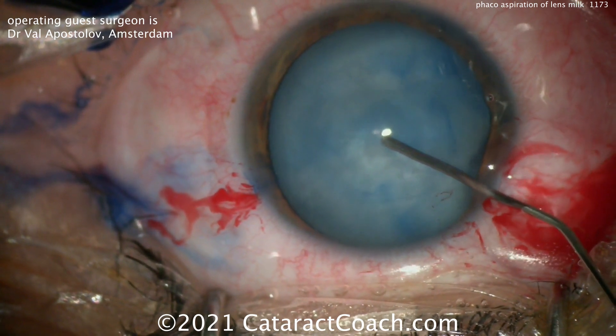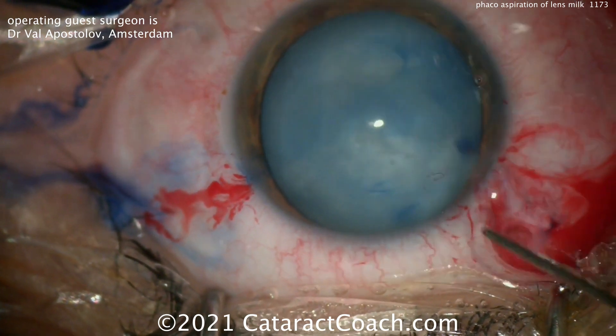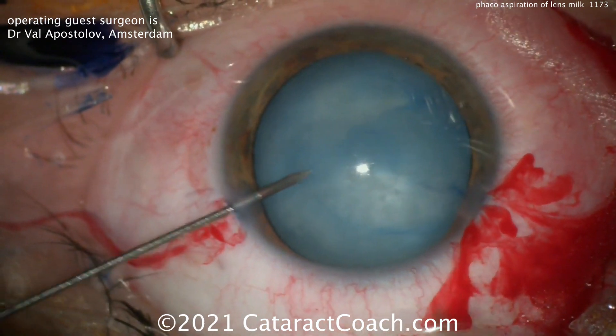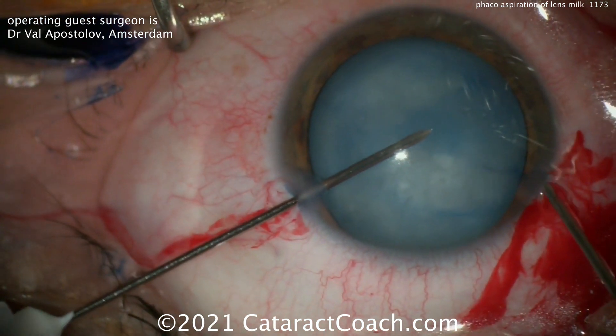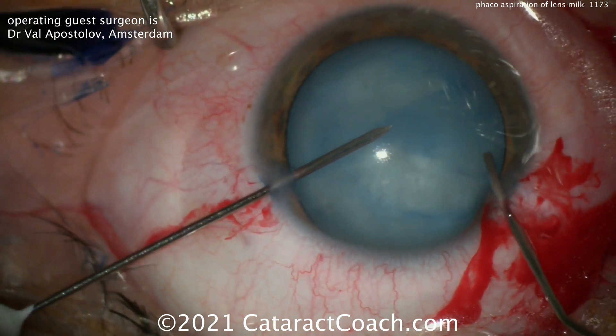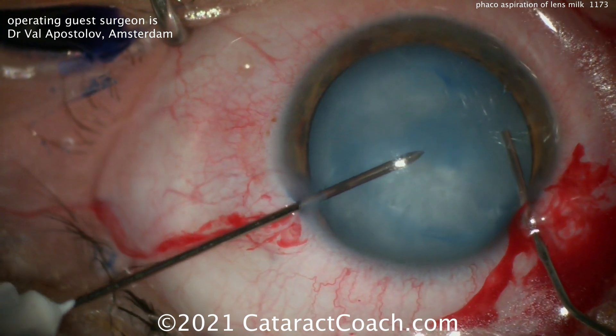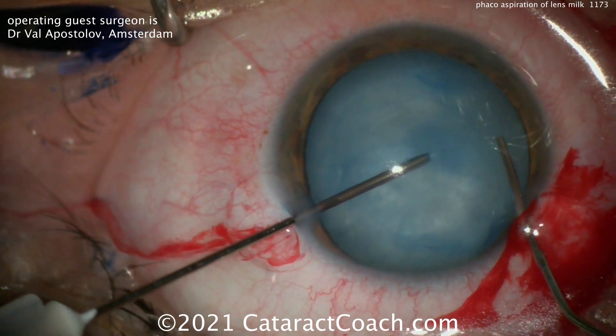You can see how liquid-filled that capsular bag is — look at the pressure within it. Now going in with viscoelastic, and then a needle on the aspiration line — that's the aspiration line. The inflow is the right hand, which is just the irrigating cannula. At the same time, stepping on the foot pedal.